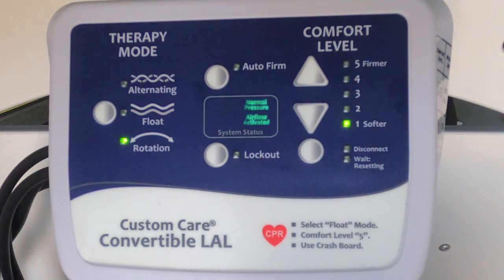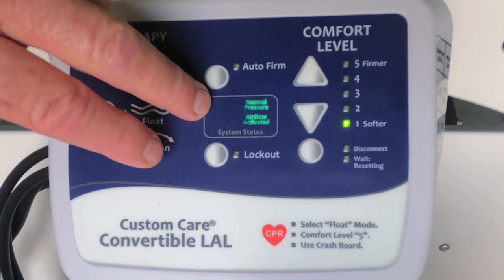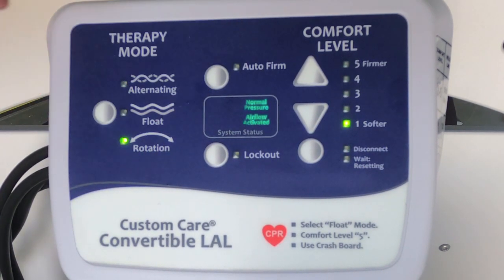There is a low system pressure indicator that lights up initially when you turn the system on, and that's only on for a few seconds. And then it goes to normal pressure, as you can see here. If the low pressure indicator comes on at any time during normal operation and stays on, you need to bring this to the attention of environmental services.